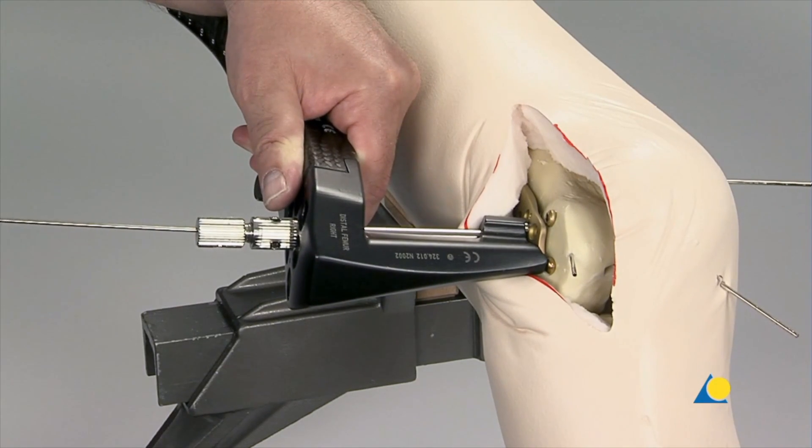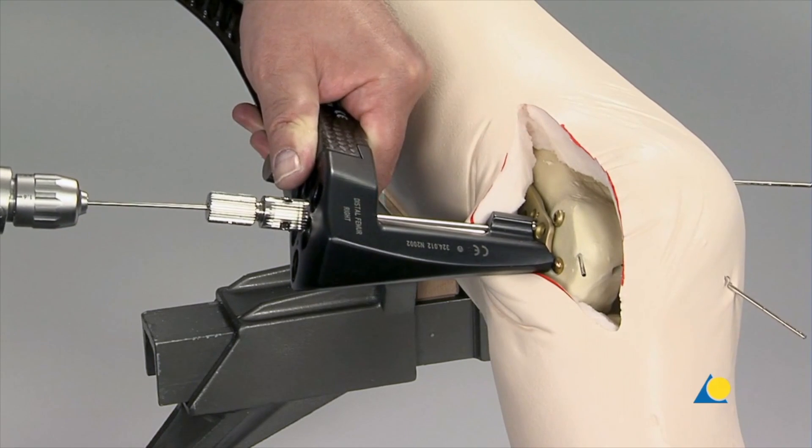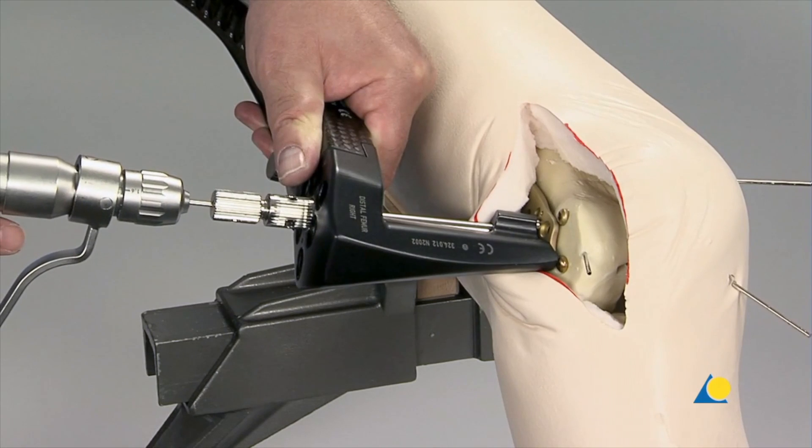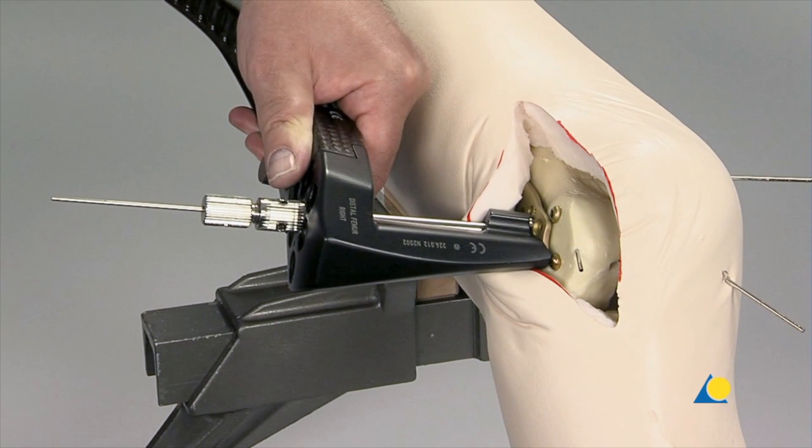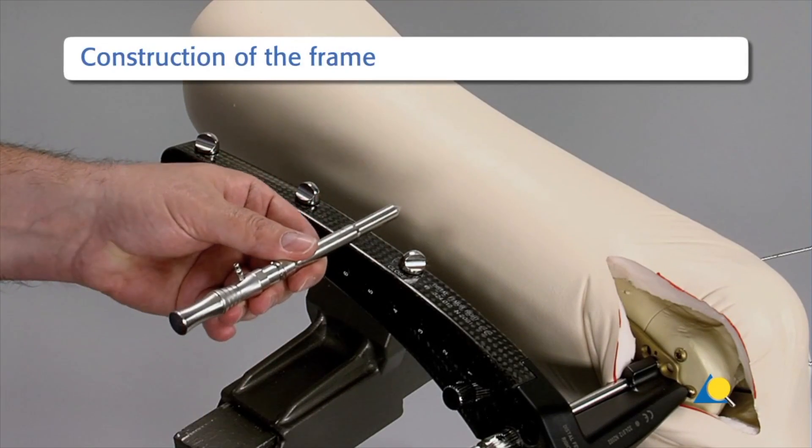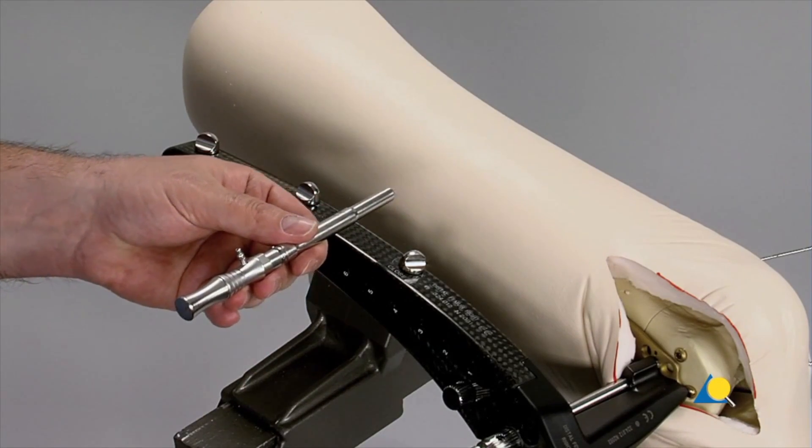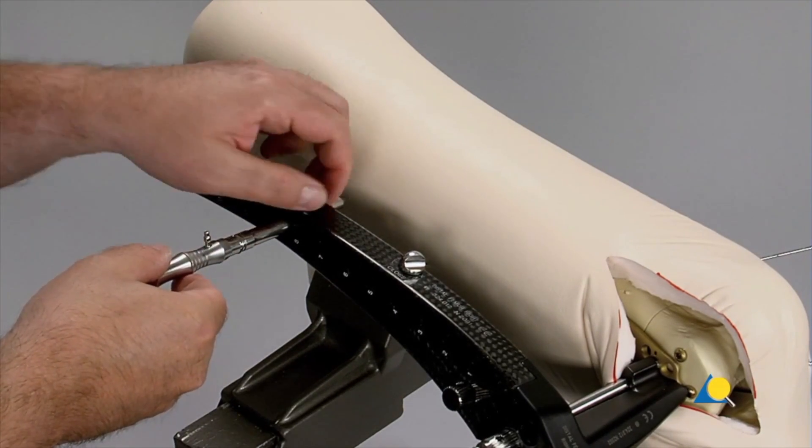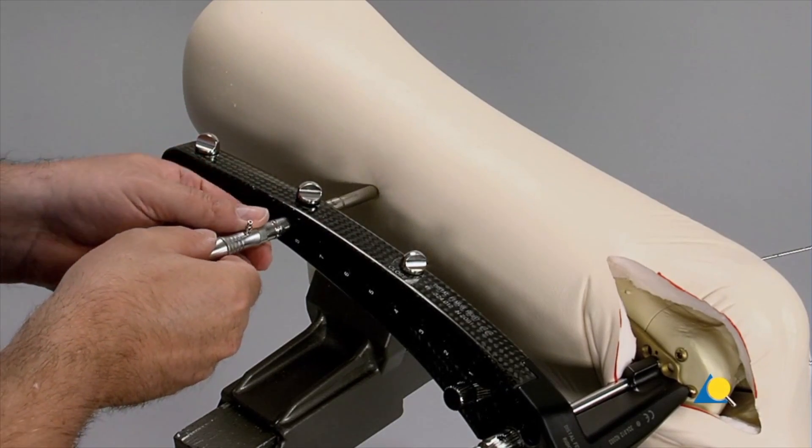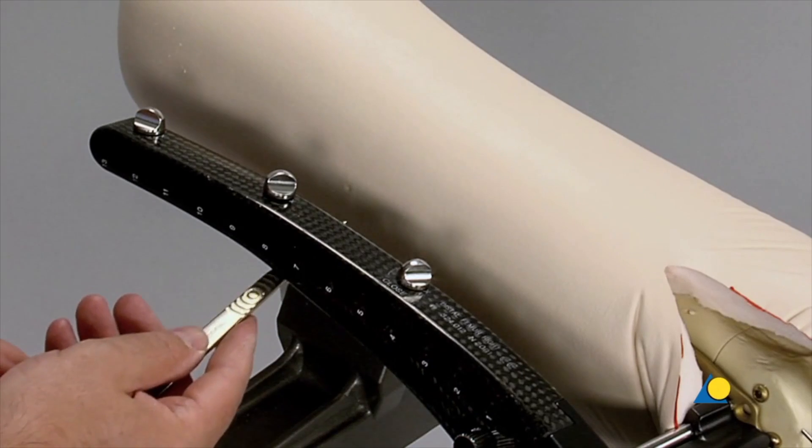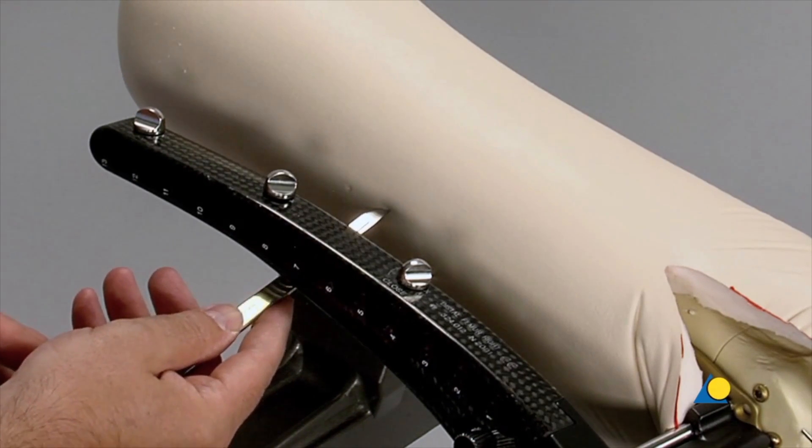The plate is fixed distally using a K-wire through the fixation bolt. The insertion guide should now be stabilized further proximally with a K-wire. The insertion sleeve and trocar are slid through the insertion guide to mark the position of the stab incision on the skin. The incision is made down to the plate with a scalpel.